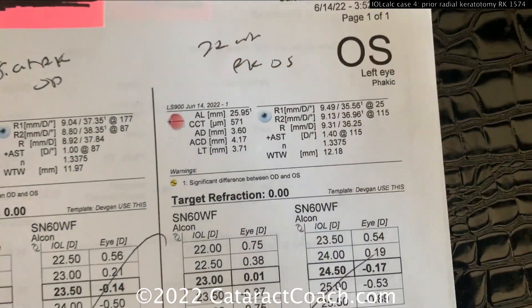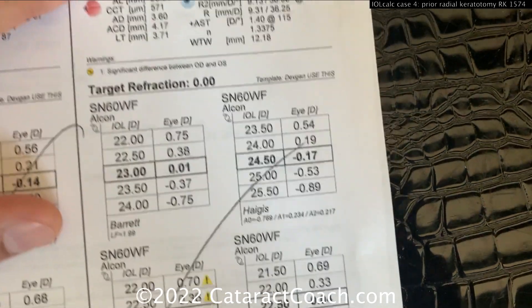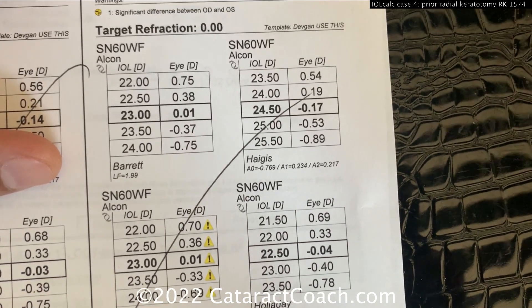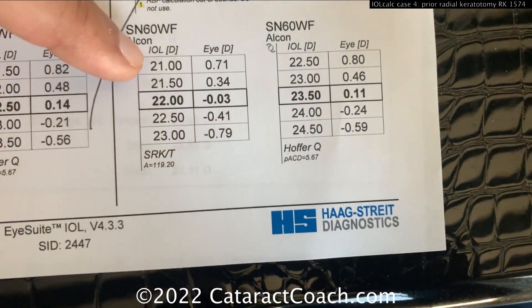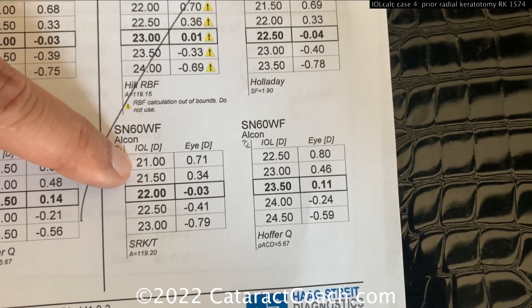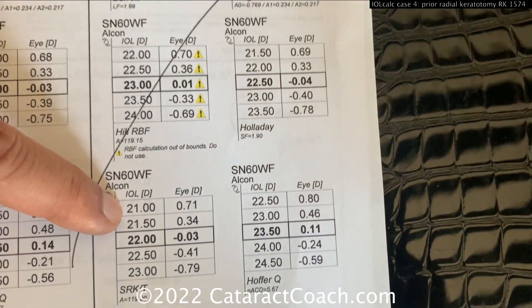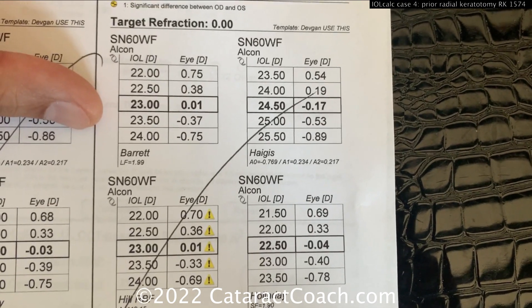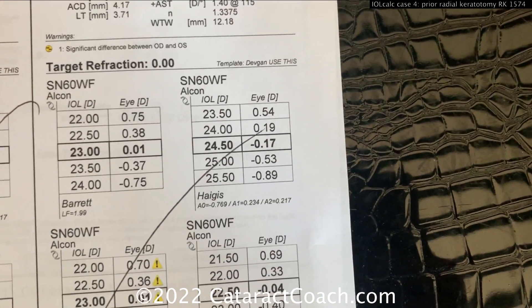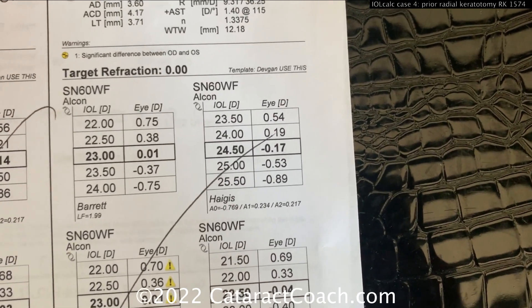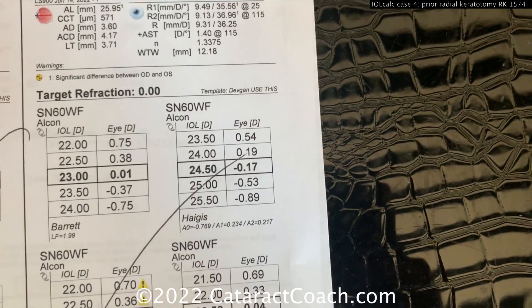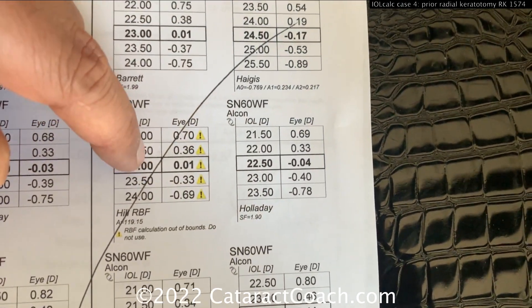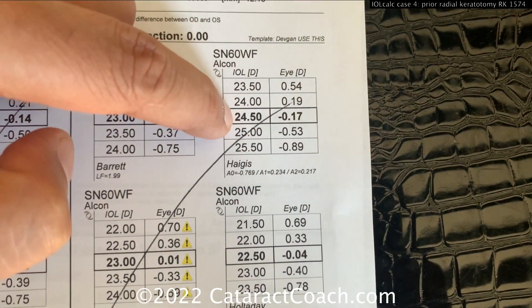Now for the IOL calculations on this 22-cut RK left eye — let's see what the formulas come up with. None of them are going to be spot on. With a really flat K, don't look at the SRK/T — that's going to be the most off. It comes up 22 diopters; if you put that in, the patient will end up hyperopic. The Haigis takes into account the actual measured anterior chamber depth and is least reliant on the K value to calculate effective lens position — it does that primarily based on the AC depth measurement — and it comes up at 24 and a half. Don't use Barrett; Graham, you're a good guy but you can't be used here, and certainly not the others either. Of all these, the only one probably in the ballpark is Haigis.